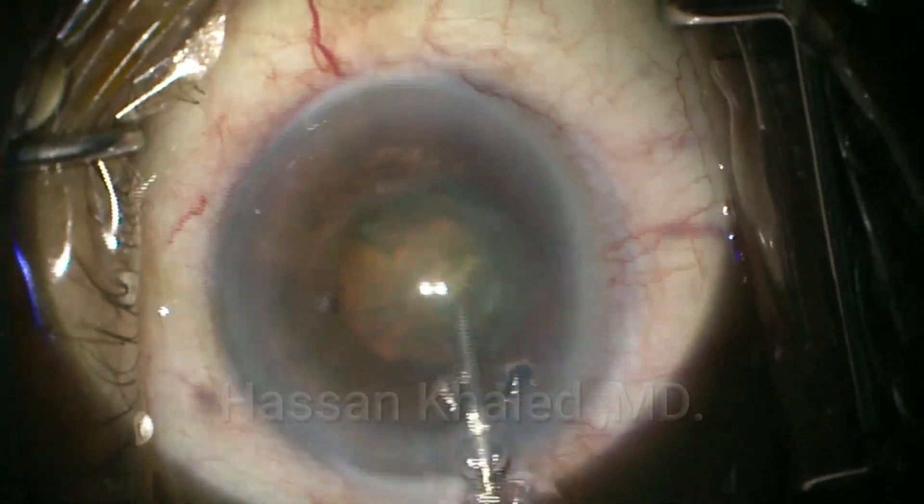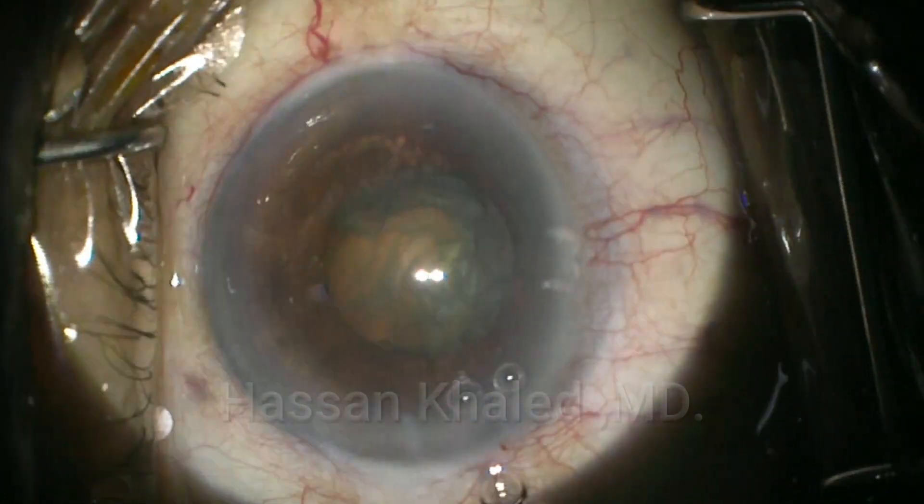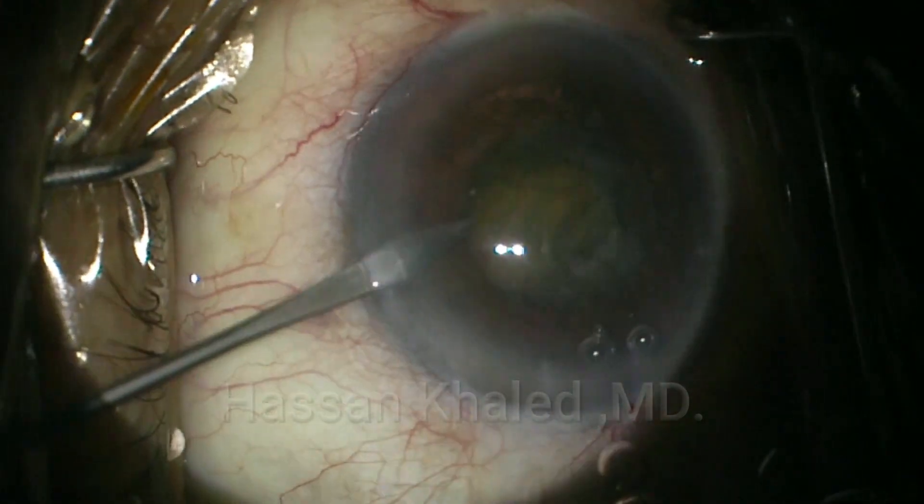Then injecting again dispersive OVD. Then I opened two side ports using the MVR blade as it's clear.